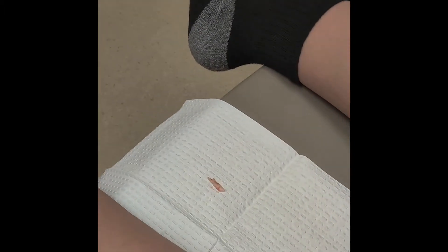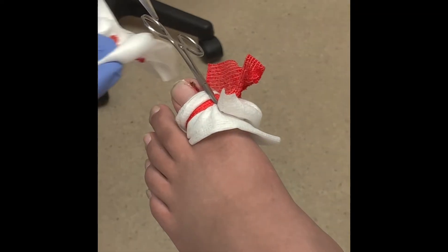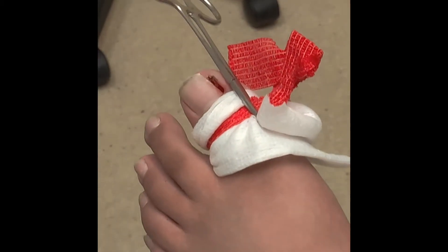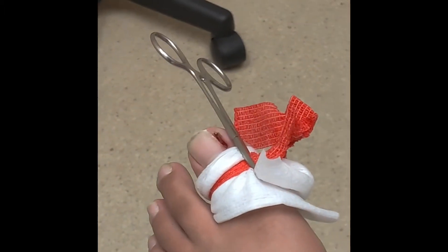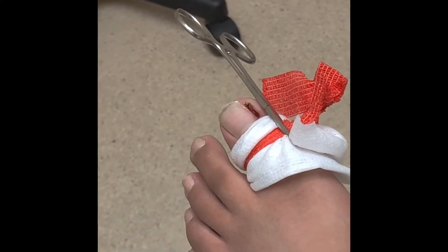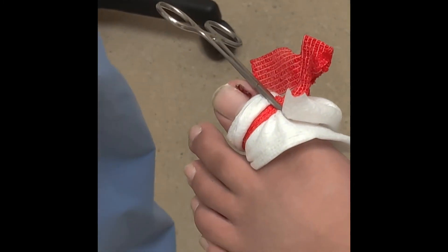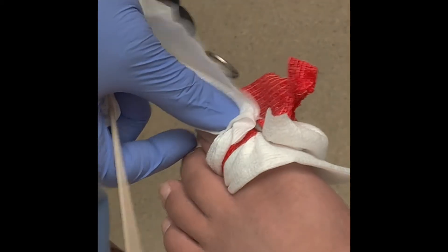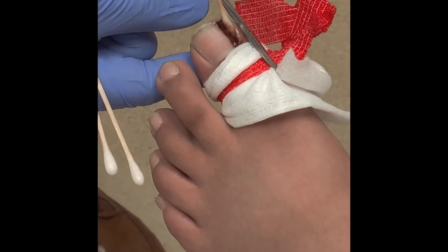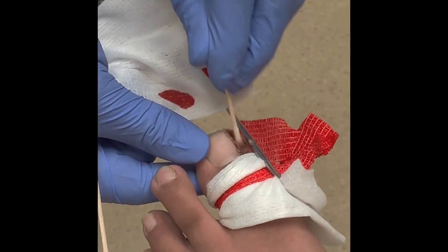And I'll just put this in there so you can stare at that. So I'm just going to dry that up with some gauze, so you can see where the nail used to be. Got a little hole there. Okay, and then I'm going to get some chemical.